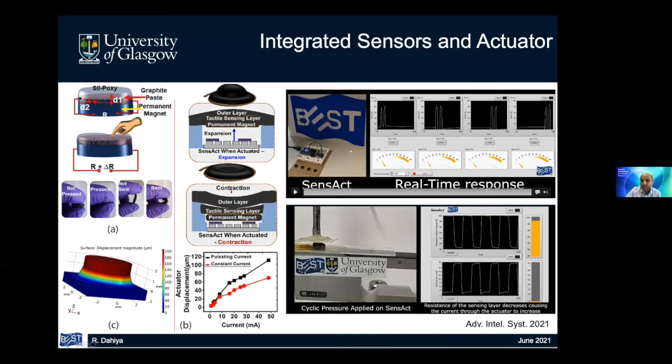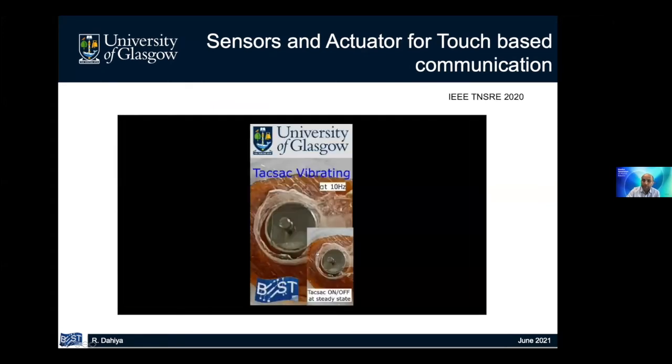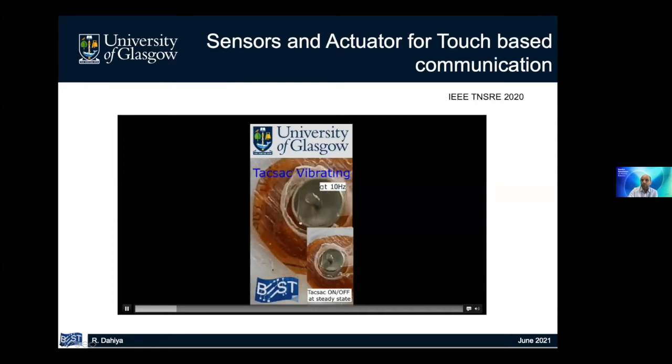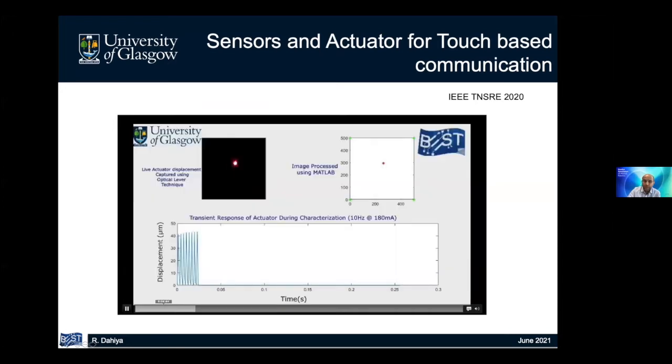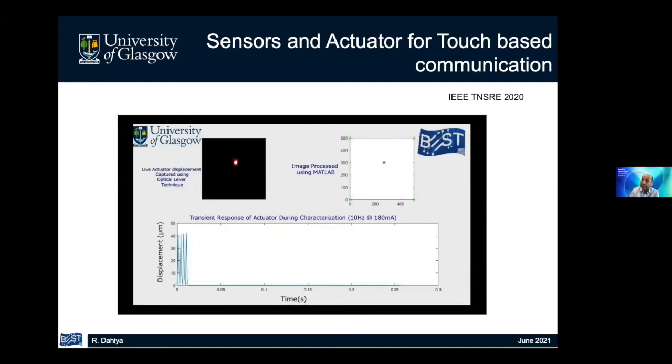We have tested these sensors, as you can see here, four sensors, in terms of variability for the same force, as well as characterizing them in a nice way. And we plan to extend this work further. As an application, you can see how the sensor actuator is working. If you put a permanent magnet here, it is able to push the permanent magnet up and down, and that way we are able to create the haptic feeling as well. With the sensor on top and actuator underneath, you can see the thickness mode movements, shown here by this laser movement. We are able to generate movements up to 200 micrometers in this way.